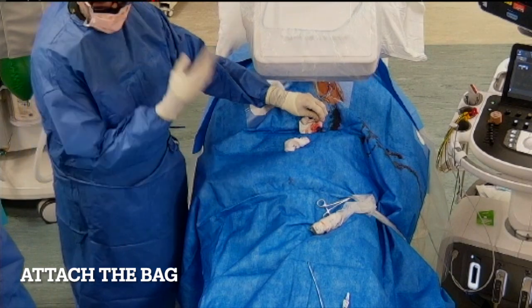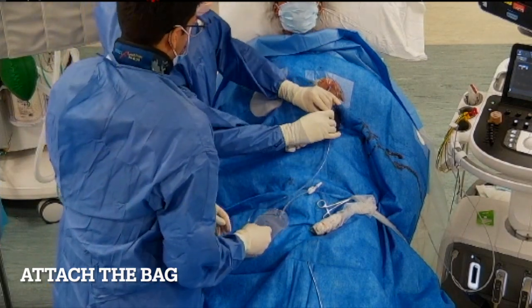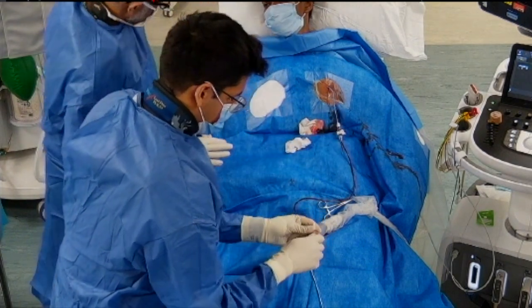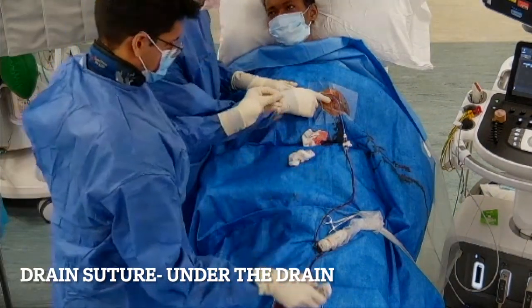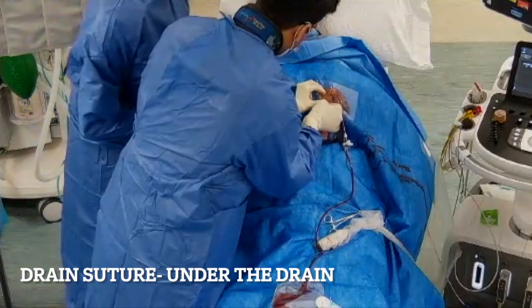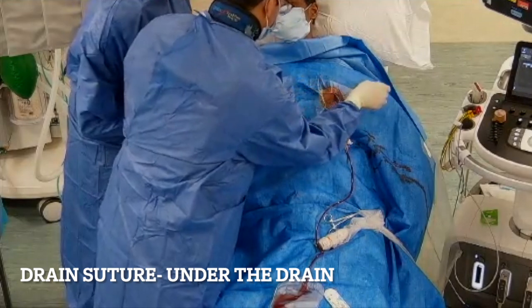We attach the bag — usually with a three-way tap between the drain and bag. It's important to check that the bottom valve of the bag is closed so fluid doesn't go everywhere. We can see the red fluid draining out. We then place a drain suture — in and out under the drain in the skin — and do a double knot that's not too tight on the skin, as we don't want to necrose the skin. The drain may be in for 24 to 48 hours.